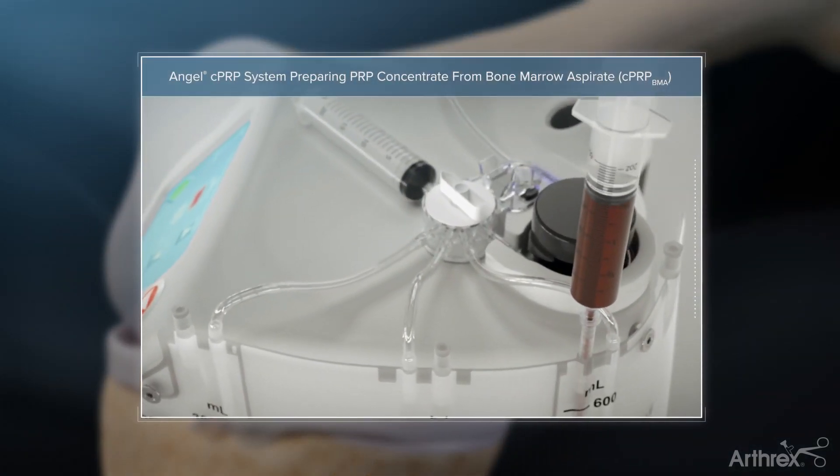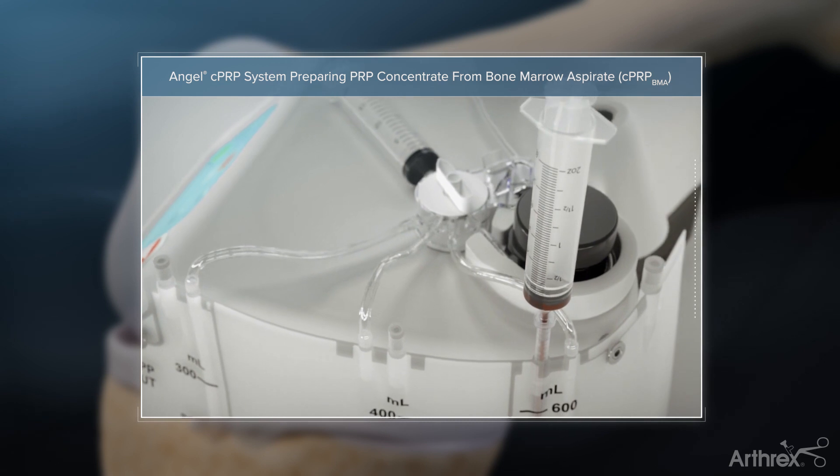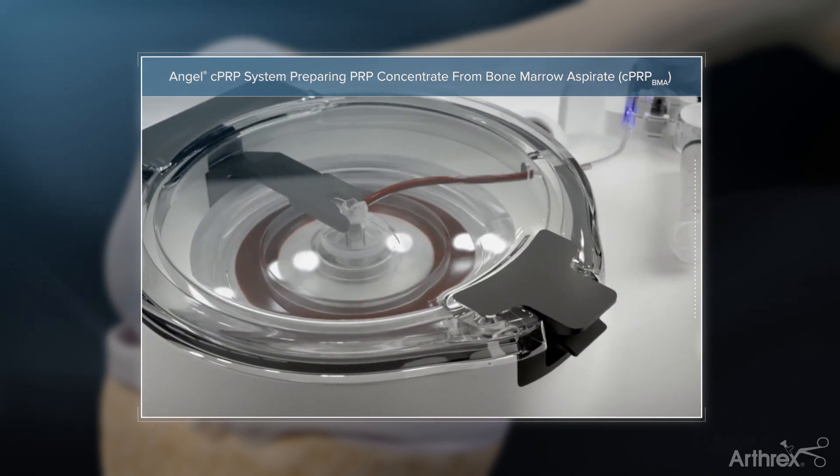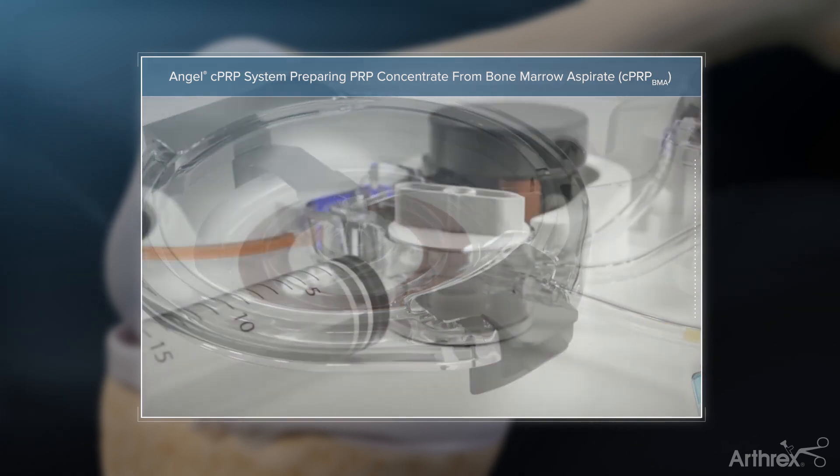Arthrex offers options for the treatment of these pathologies by performing a core decompression of the lesion and a direct application of concentrated bone marrow aspirate using the Arthrex Angel system.